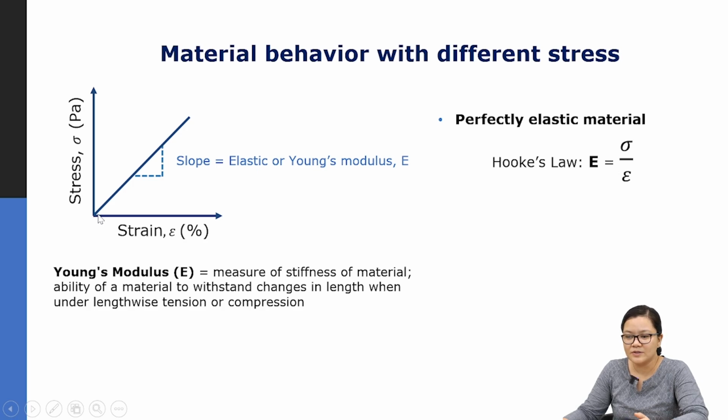And we know from this stress-strain curve, assuming that you are within the linear elastic regime, the slope of this stress-strain curve is the elastic or Young's modulus, denoted by E here. Now, of course, if you keep stretching, the material behavior will change. There will be some other deformation, or plastic deformation, that will occur. That means if you stretch the material, it will not go back to its original position.